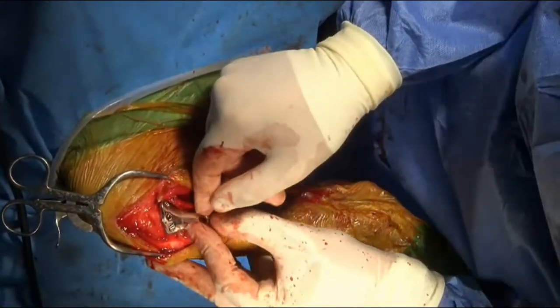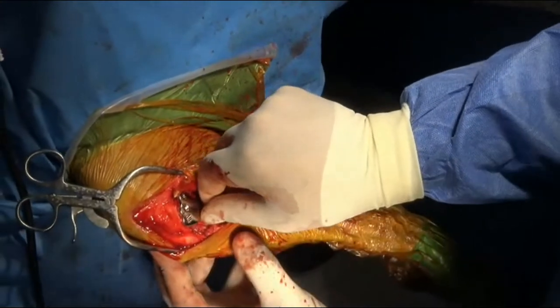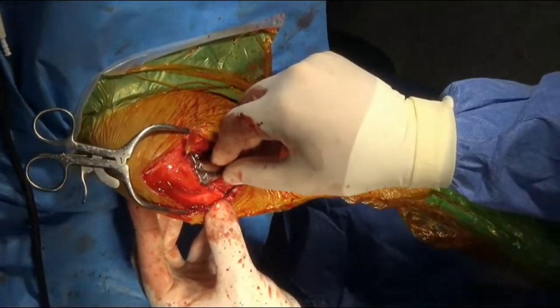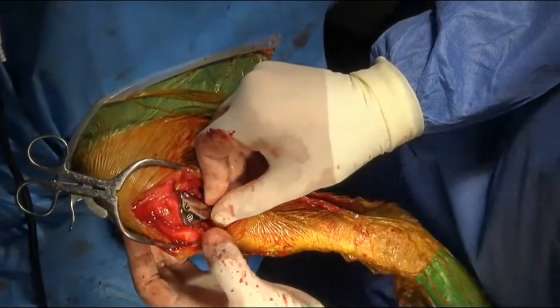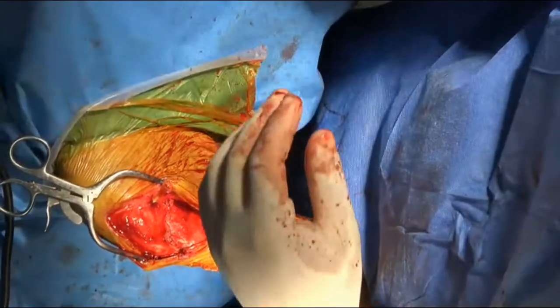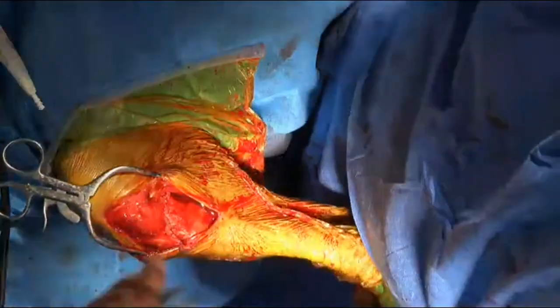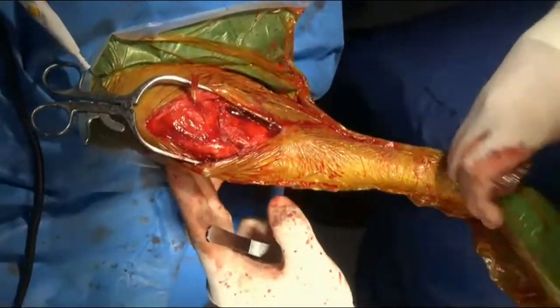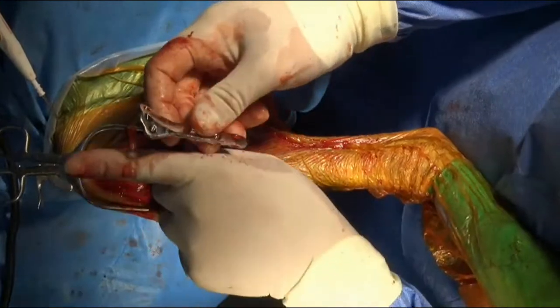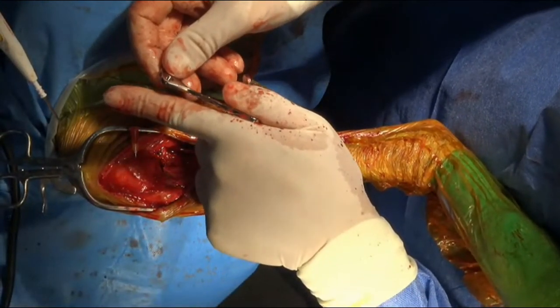So just give me a sec there, Ewan. So I need to make sure that everything's going to sit down as we want. It's got a fair bit of buttress on this knee, which I might take off just to get that plate to sit a bit better. So the problem I've got at the moment is that because of this buttress, the plate's sitting off the bone like this a little bit. So in this distal segment of the bone, it's not actually sitting hard up against the bone because there's buttress at the top and it's pushing the plate off a little bit.